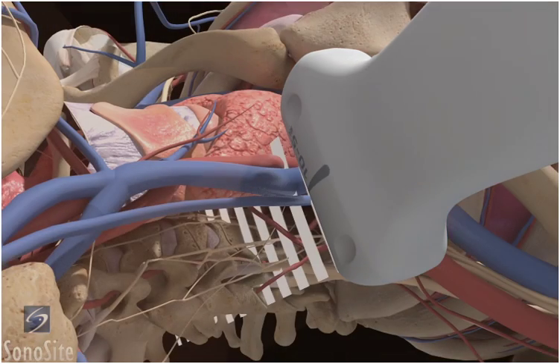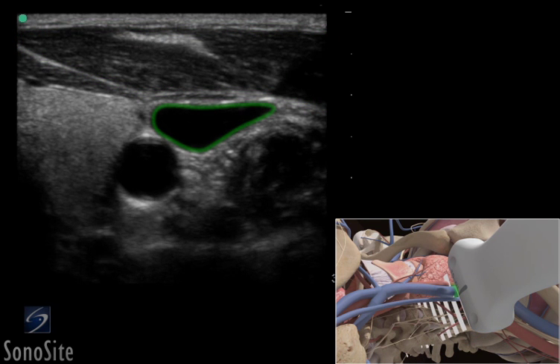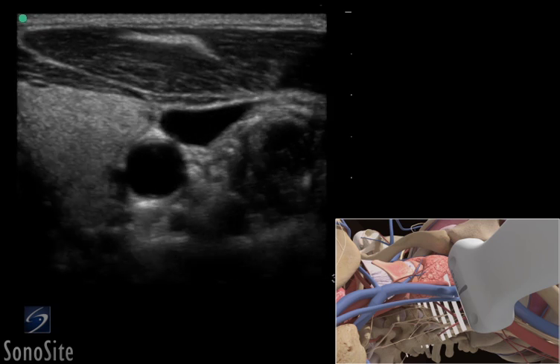The most superficial structure identified in the ultrasound image is the sternocleidomastoid muscle. Deeper to this, the internal jugular vein will appear as a dark anechoic elliptical shape and is compressible with transducer pressure.